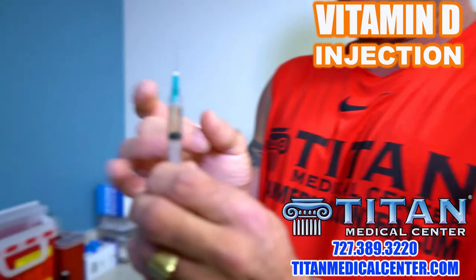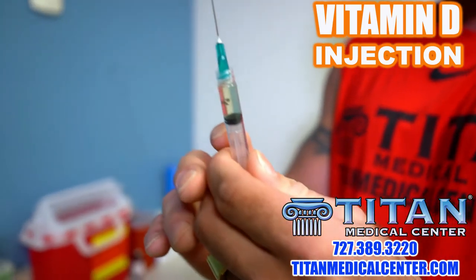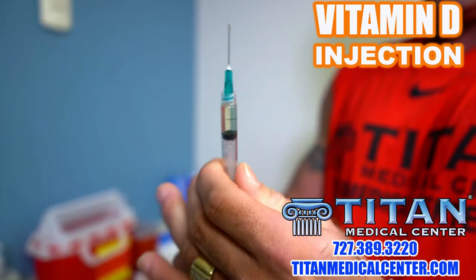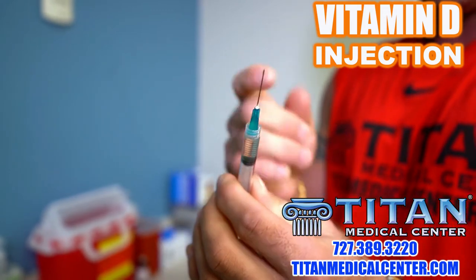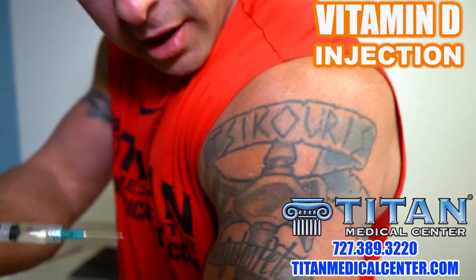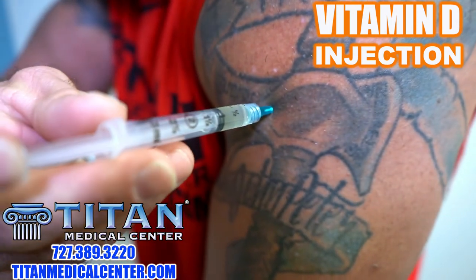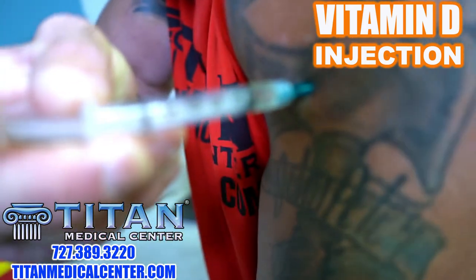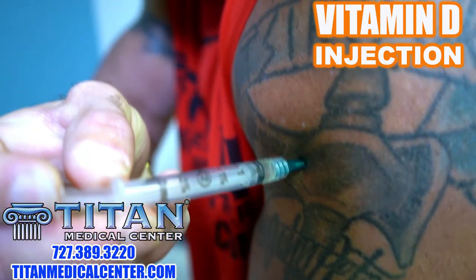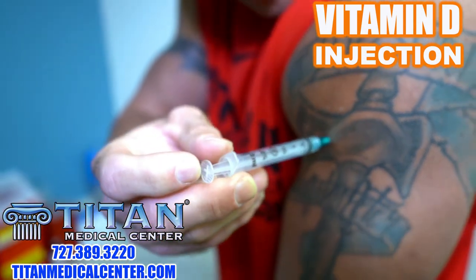This can be a little scary for some people — it's not a little insulin needle. There's a 23-gauge needle on here. You can use something smaller like a 25-gauge, but 23-gauge is going to let you inject smoother, because the smaller the tip, the harder it is to push that viscous oil through. So going center of the shoulder — we go in, push in nice and smooth all the way down. See how slowly it goes in? That's the viscosity of the oil. It's all in — real easy, real smooth.